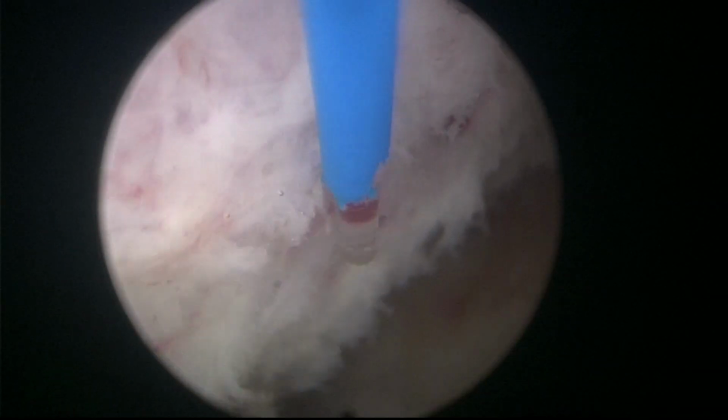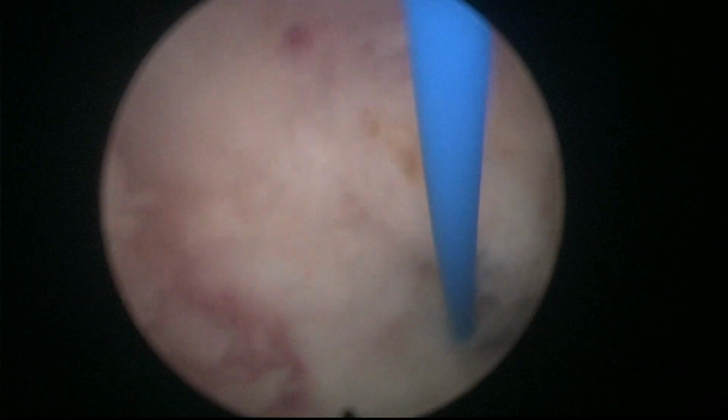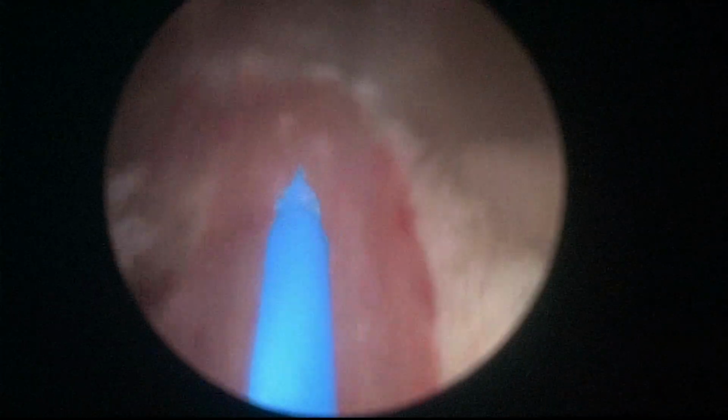to push it in the bladder like that. You see, now I push more, and then this is going to rotate the prostate. You see, this lobe went inside, and then instead of pushing that one from that side, what I'm going to do is continue the rotational movement here like that, you see, and then it goes in the bladder. So it's a beautiful enucleation case.